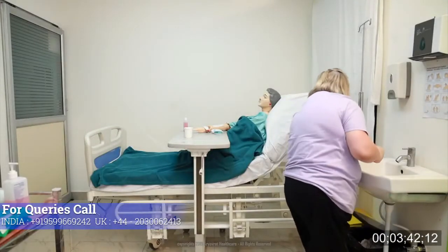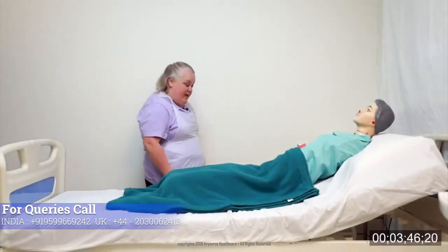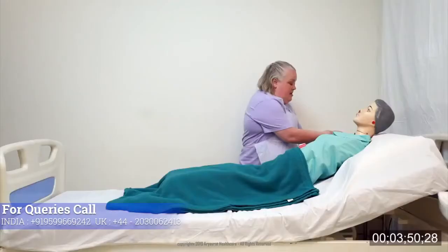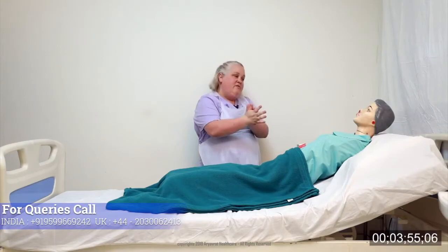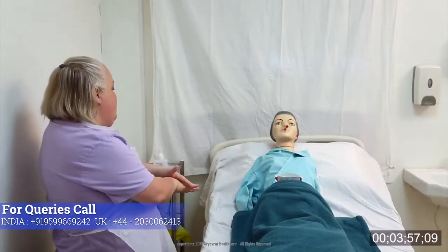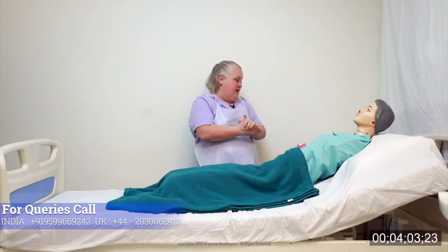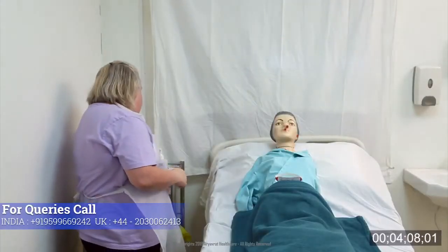Making sure that my hands are thoroughly dry. So, I'm back with everything, Helen. Hi. Okay. Have you ever had a catheter in before? No. Okay. So as I said earlier, there will be a bit of a stinging sensation, but hopefully it shouldn't last for too long, okay? Okay.